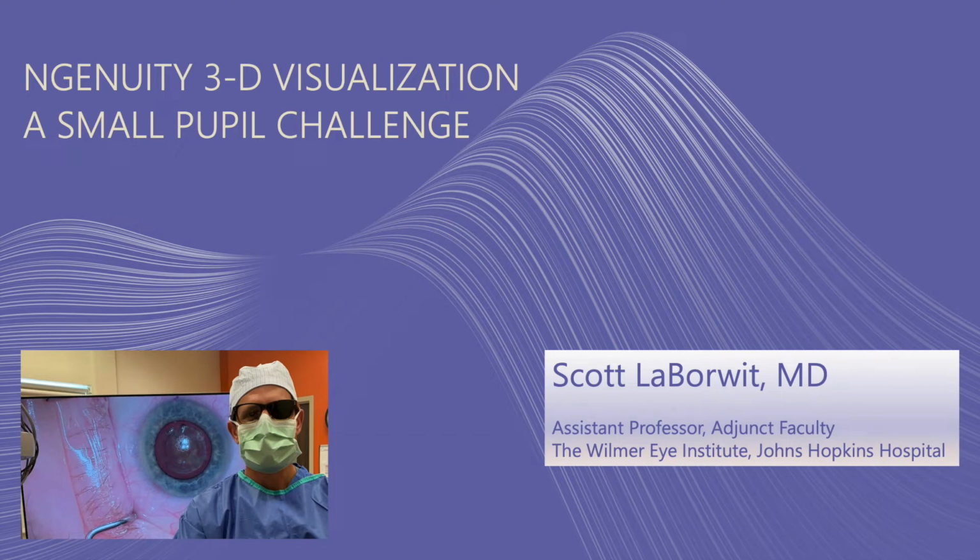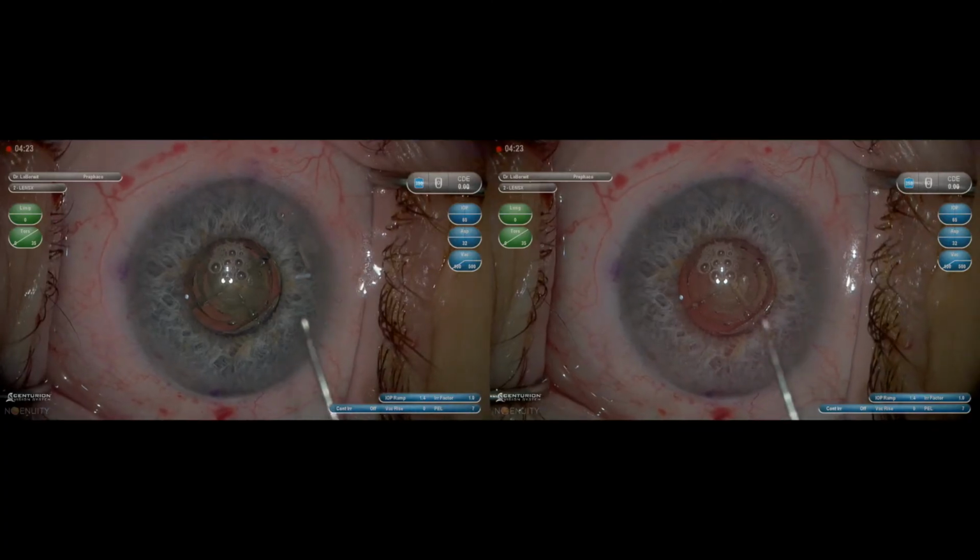I want to share how I use the Ngenuity 3D visualization system in a small pupil. I'm a consultant for Alcon.